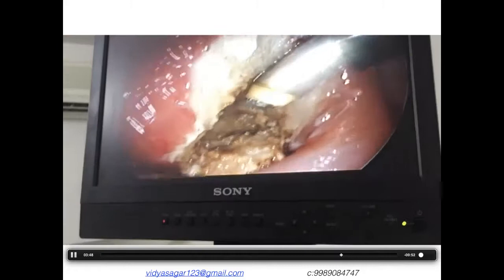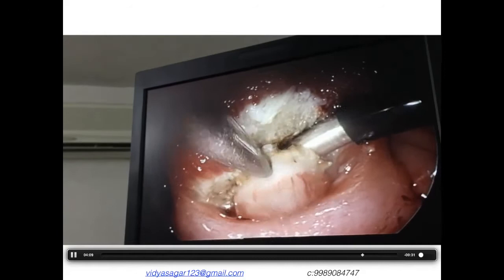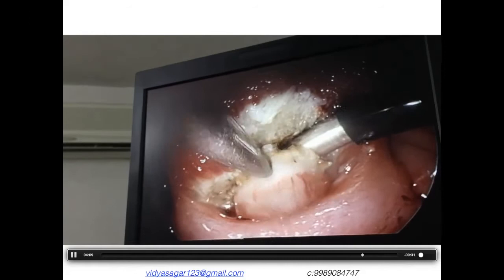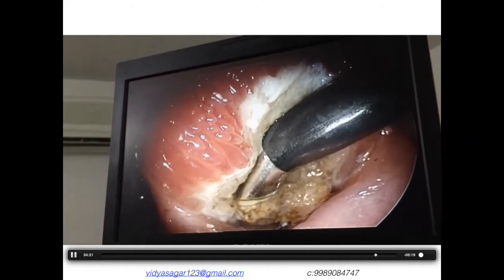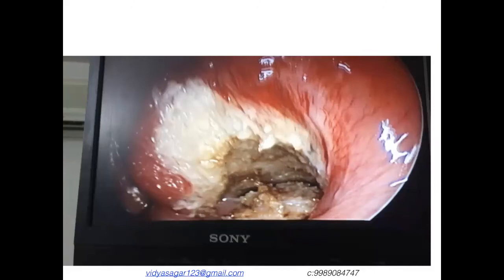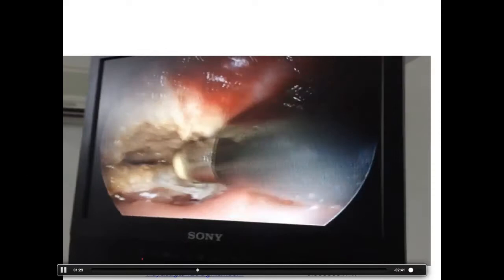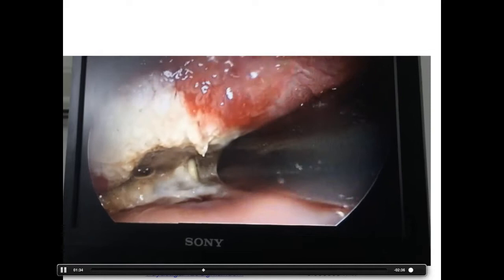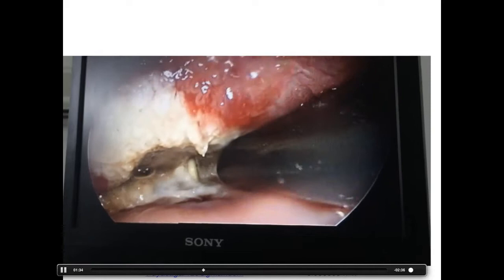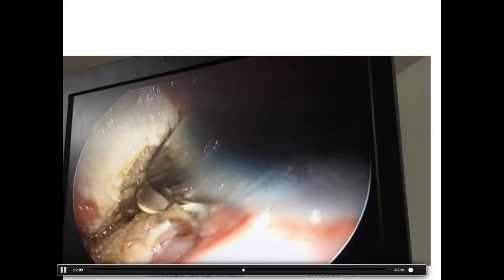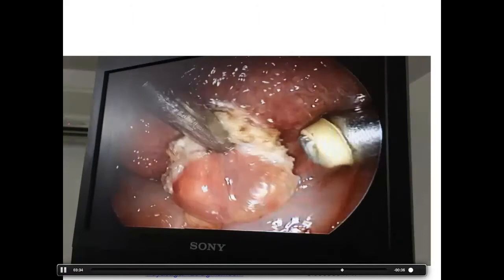This is one of the best uses of the coblator — the tongue base — where we can totally avoid an open approach. It gives a completely hemostatic field with very less thermal damage. Using the coblator wand, the endoscope, and the retractor together in a day-one child, we were able to go all around the lesion and excise it in total.